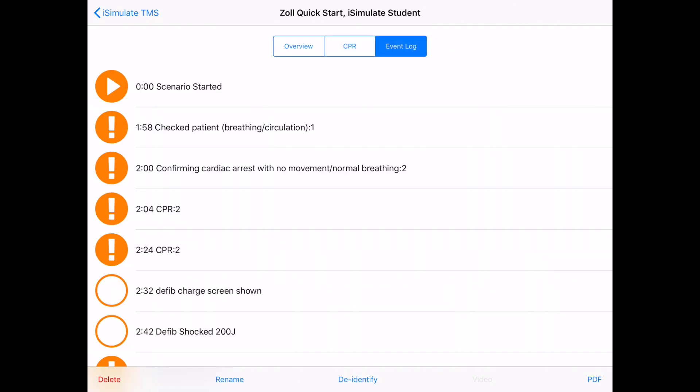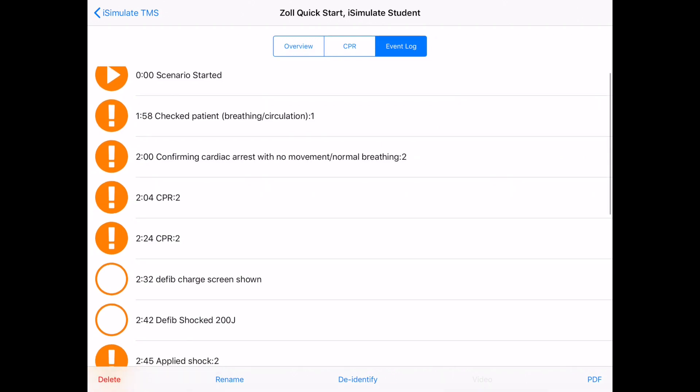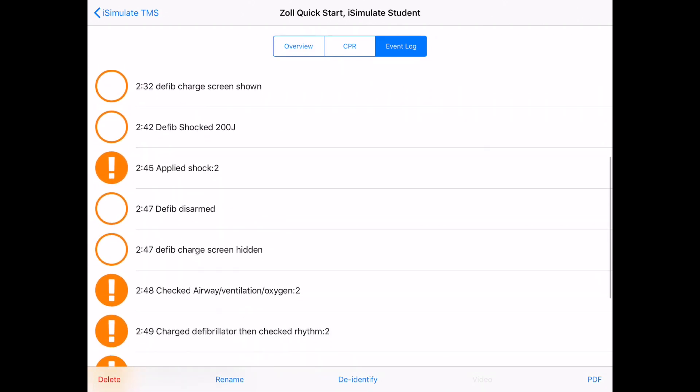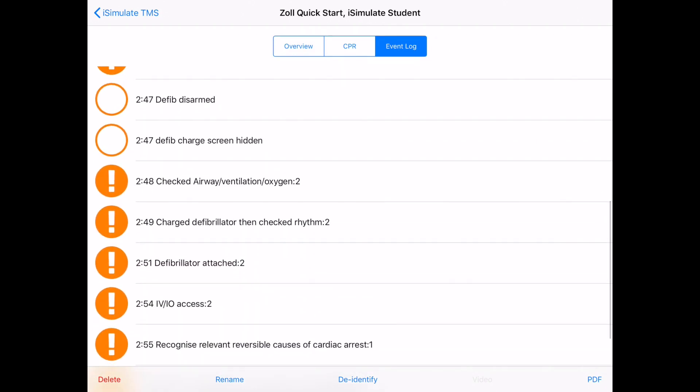The event log shows me all of the moments that happened during the actual scenario. So you can see I've checked patient, confirmed cardiac arrest, but it also picks up things such as when the defib was actually used.